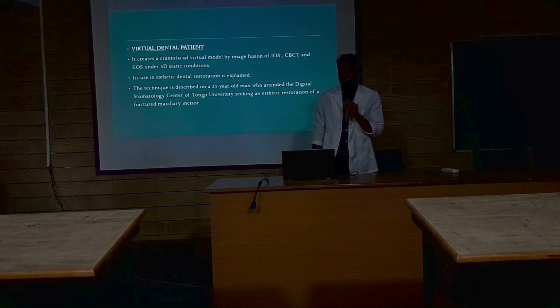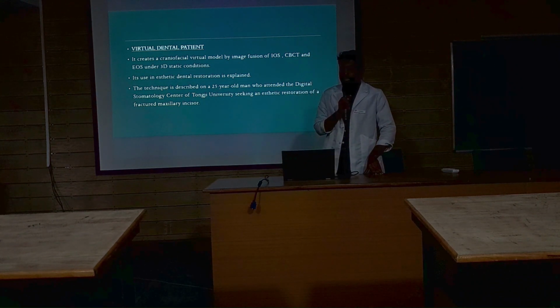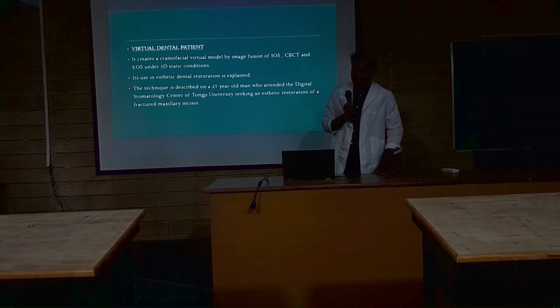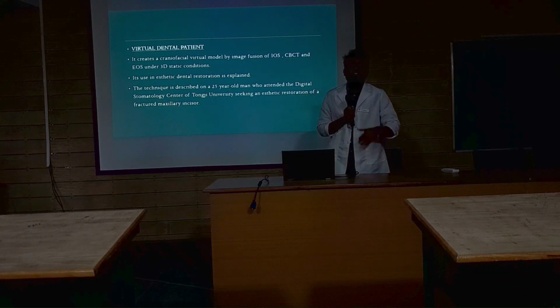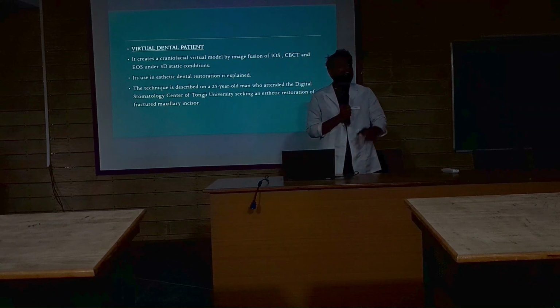Then we have the virtual dental patient. It creates a craniofacial virtual model by image fusion of intraoral scanner, CBCT, and extraoral scanner under 3D conditions. So imagine a patient coming to us who requires some treatment, maybe some aesthetic corrections. So we create that patient.